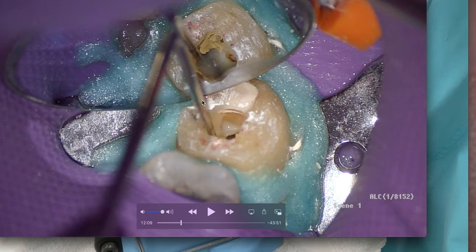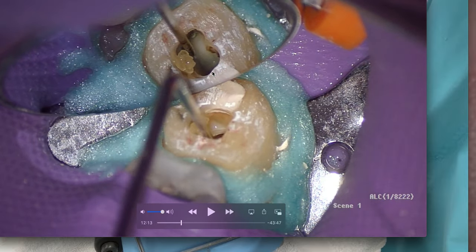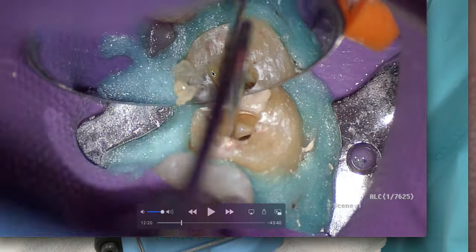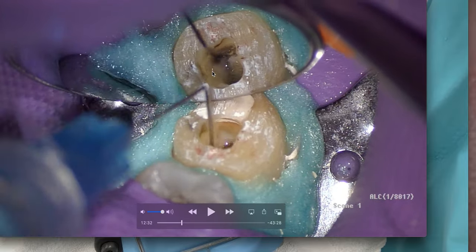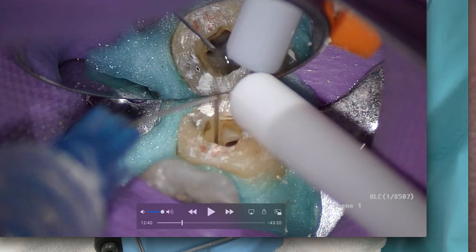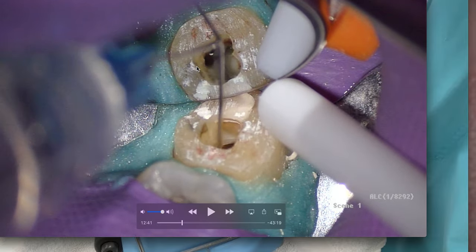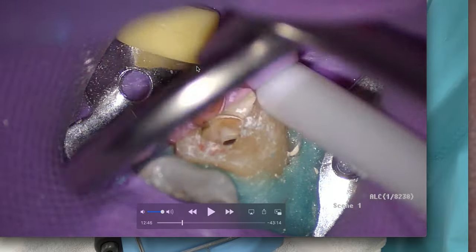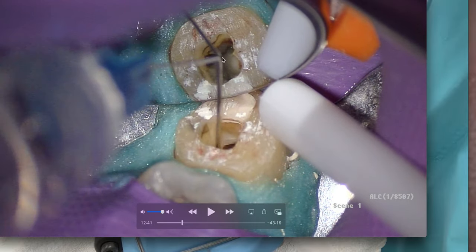Using the law of symmetry — Krasner and Rankow, 2004. I'm going to flick out this pulp stone — actually I put it on my mirror and said 'this is a gift for my dental assistant.' Now I'm going to irrigate all this junk out. Watch what happens: I'm going to pull back on my irrigating syringe and it's going to suction the irrigant out of the distal. This gets rid of the irrigant connecting all three canals, which can really confuse your apex locator — especially if there's a restoration or caries present.